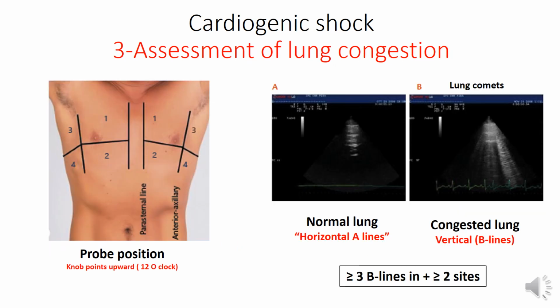Third assessment is assessment of lung congestion. There is a valuable tool that is mostly overlooked, which is lung ultrasound. It is a simple maneuver, knowing that the lung tissue is full of air, and air is a bad conductor of ultrasound waves.